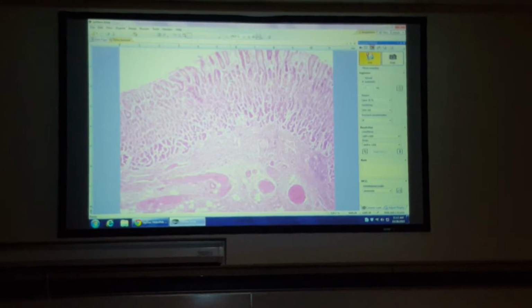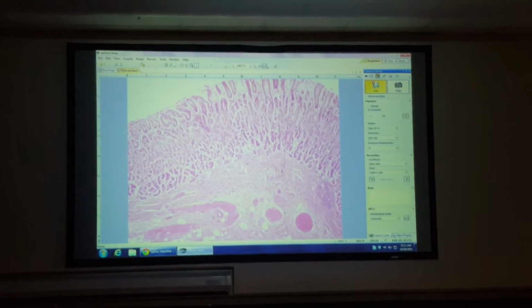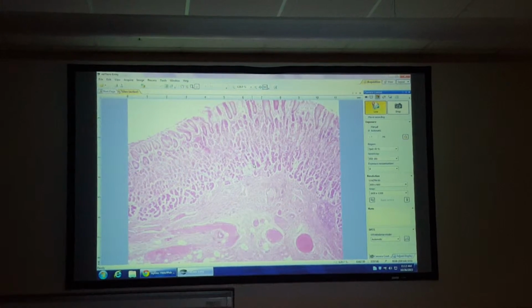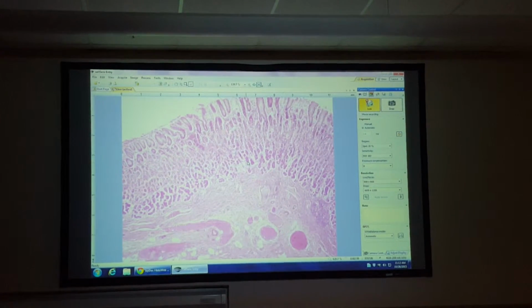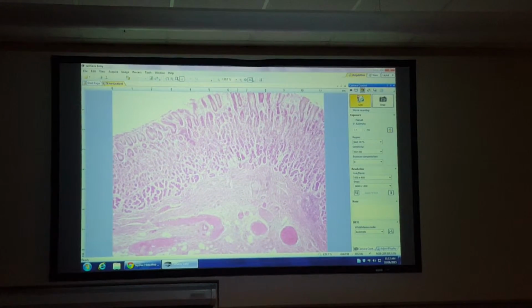Down here, all these things that show up as these little circles, like here, or here, or here, or here, or all the way down to here, those are gastric glands. It's not like in the drawings where you can actually follow the pit and watch it split up, because these things kind of wiggle around. And so you're going to keep cutting through it in different circular profiles. That has to do with the way it was cut.